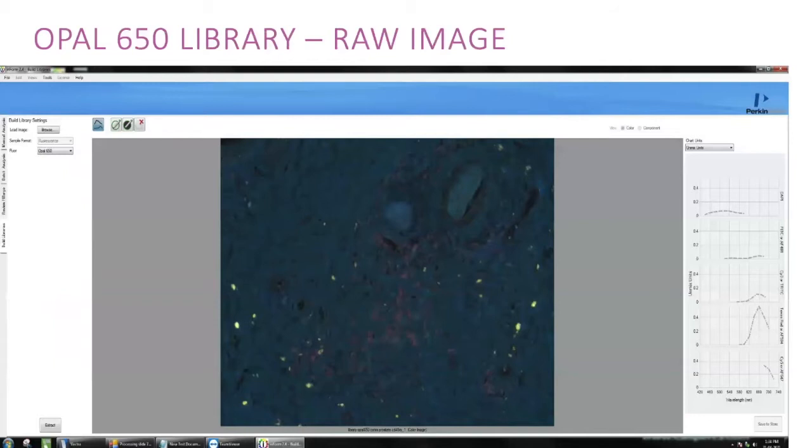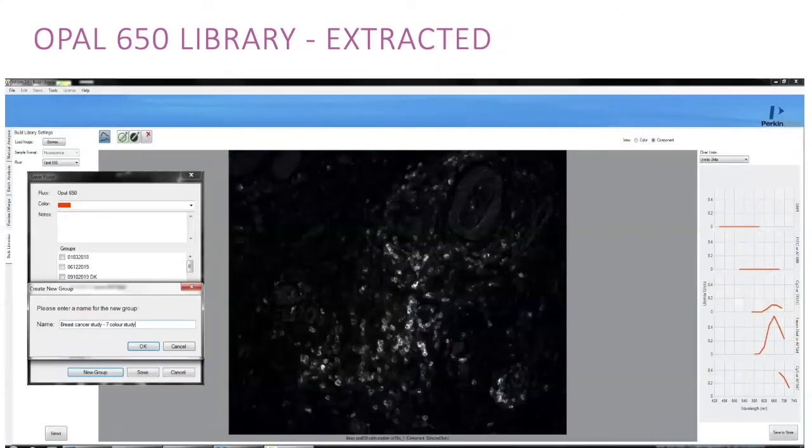Here we have the raw spectral image for opal 650. And as you can see on the graph on the right, there is an emission peak in both Texas red and Cy5 epi cube filters. And here we have the extracted or spectrally unmixed image with CD45RO cells shown in white. On the right, you can see the emission spectra with the main peak in the Texas red channel and a smaller peak in Cy5.